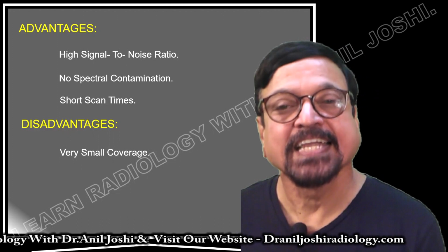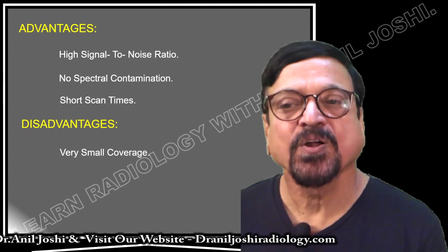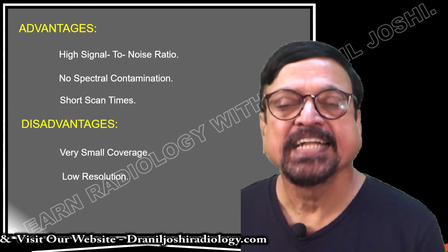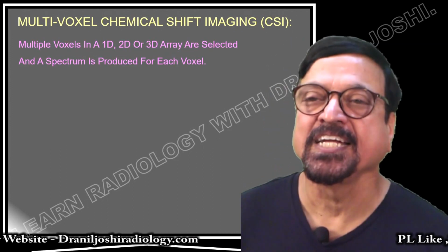Now we are at single voxel. It has a high signal to noise ratio, no spectral contaminations, and short scanning time. Disadvantages: it has a very small coverage and low resolution. So we have to go to multivoxel chemical shift imaging.